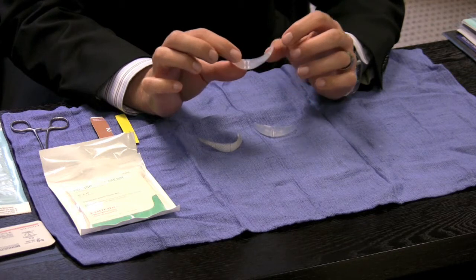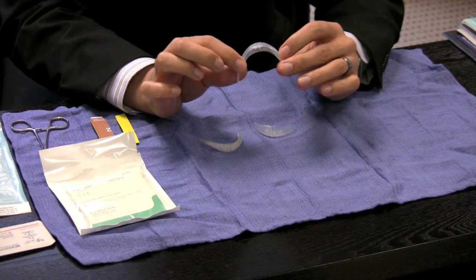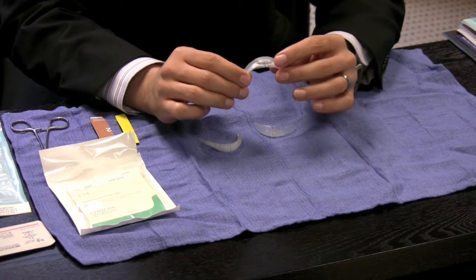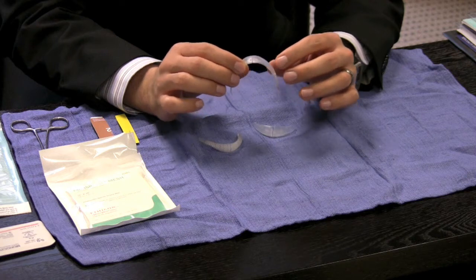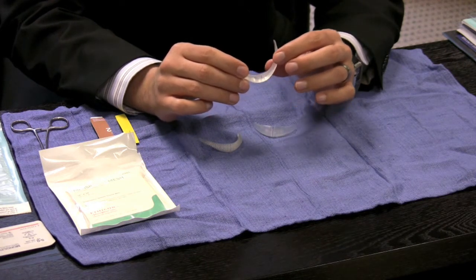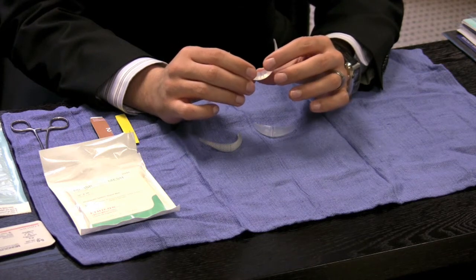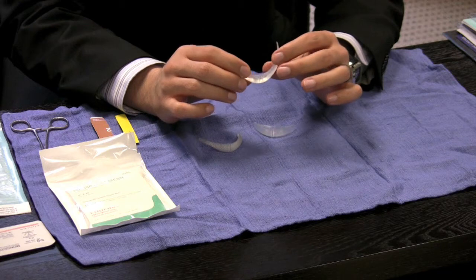And especially in women, they make the chin a little bit too square and a little bit too masculine. And I just don't personally prefer these. I've never seen one that looked really natural, especially in women. I've never seen one that looked very feminine. And again, when you feel the edges of them on your chin later on, pretty much forever and ever you can feel the edges of them, and they can shift and move.